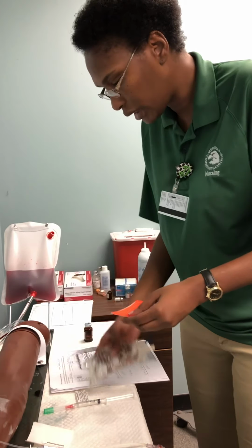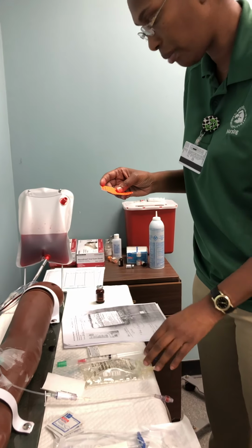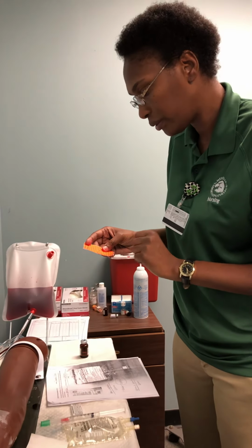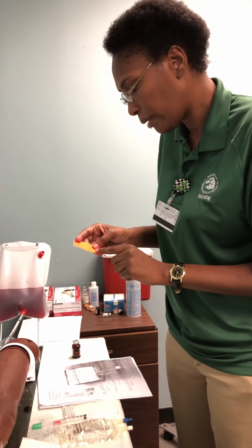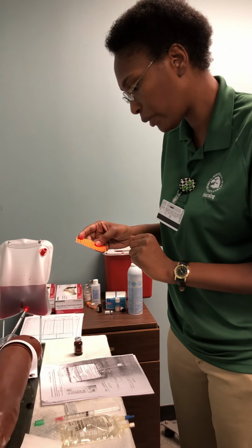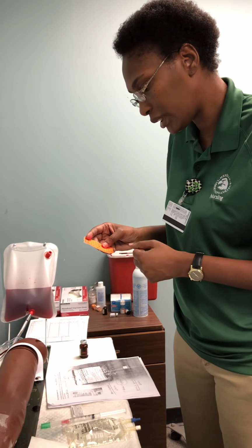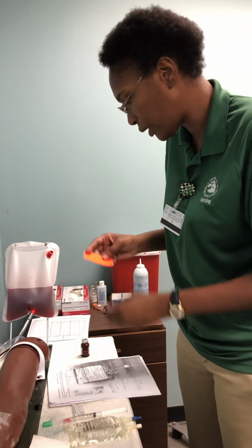Then I will label my gentamicin with the drug additive, which is gentamicin, the amount 60 milligrams, my initials, date and time, the expiration date, the patient's name, room number, start time, start date, the flow rate, which is 17 drops per minute, and that is in D5W, 100 mLs.